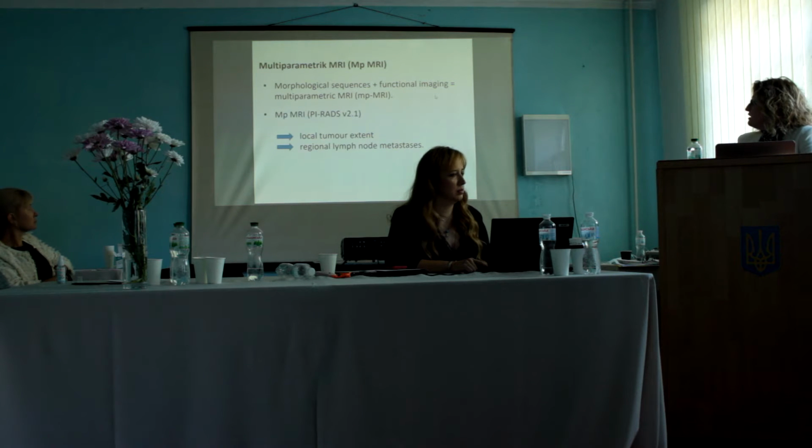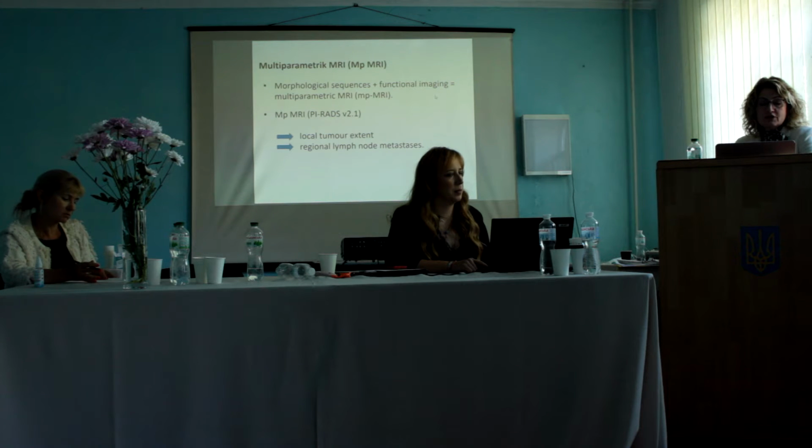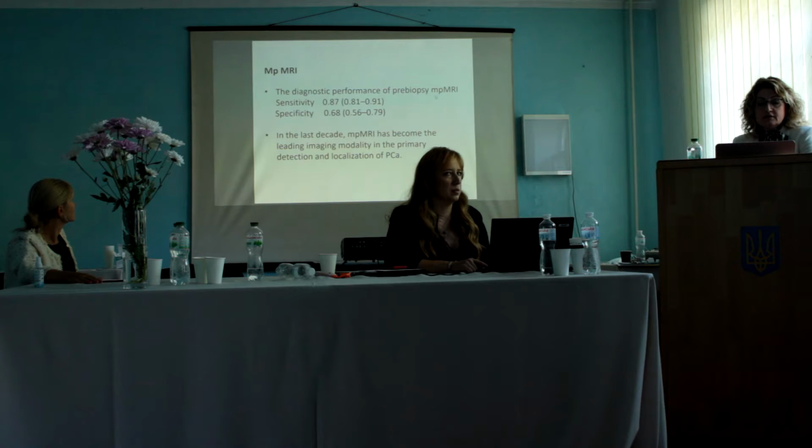A combination of morphological sequences plus functional imaging, multiparametric MRI, and a standardized interpretation system, PI-RADS, are being increasingly used for evaluation of local tumor extent, and it plays an important role in the detection of metastatic lymph nodes. For pre-biopsy MRI, sensitivity is high, but specificity is moderate, with an extreme range of negative predictive values.